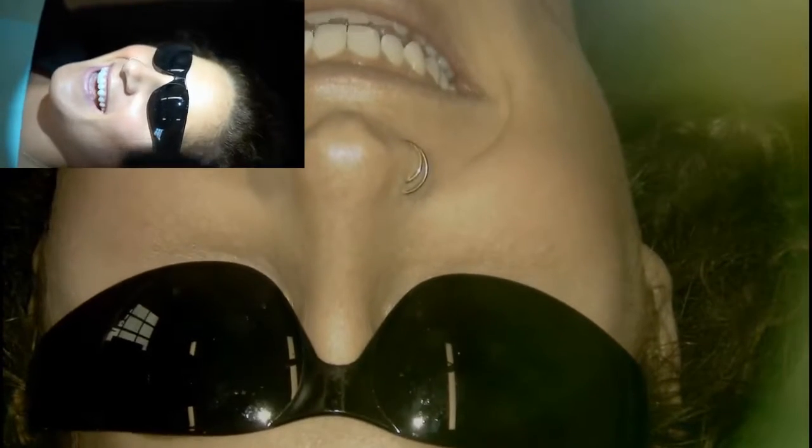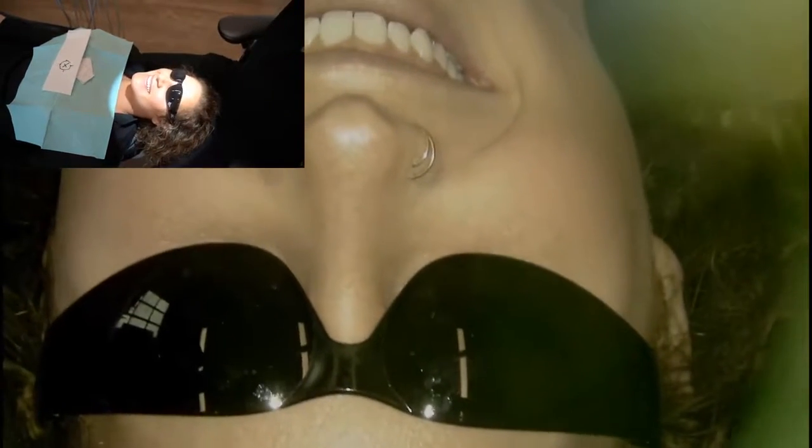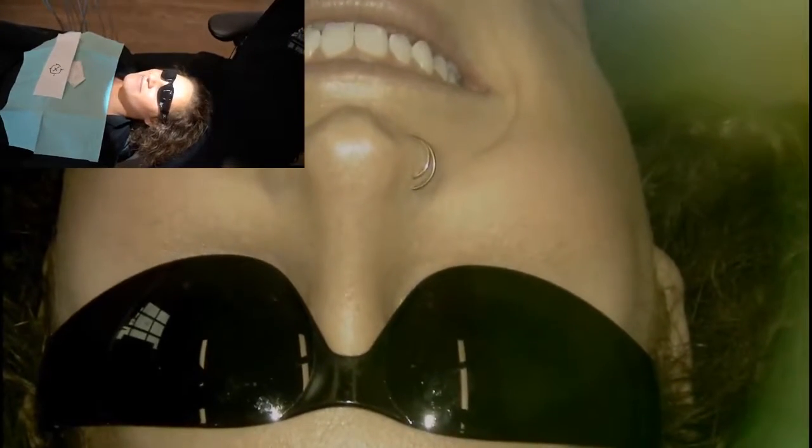But if I come back up now with dark glasses on, see how cool she looks? And then I can get her in focus here. Now, maybe you're too young. Did you ever see Happy Days? Do the Fonzie, like, hey. That dates me, but I was a little kid when that was out. All right, so then it's better for her eyes. Now you can see her eyes through those glasses. She can see. It's not super bright.